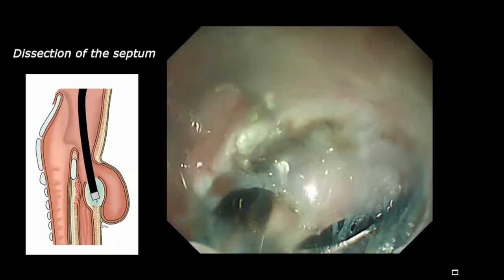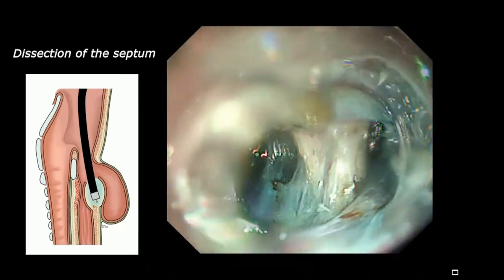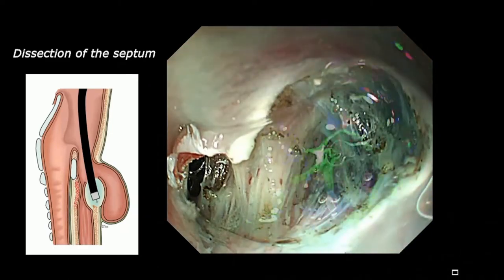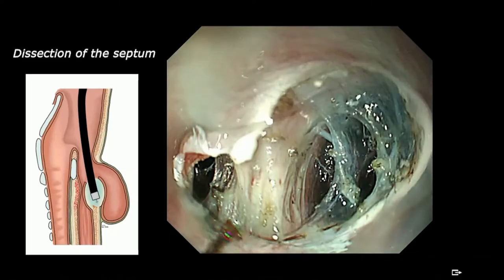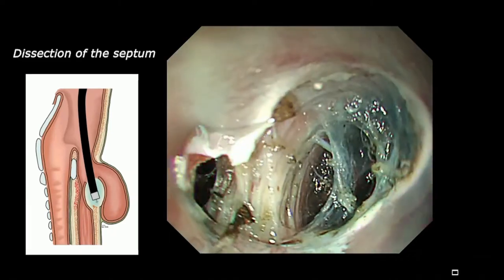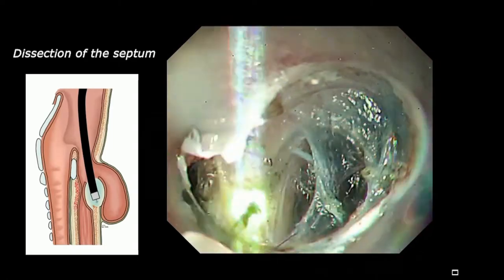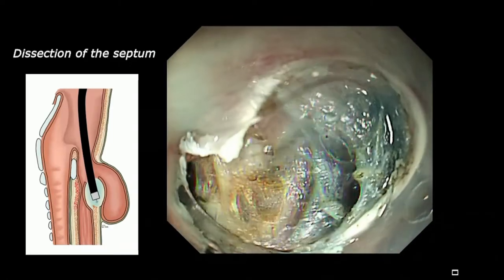At this moment, it used to be that we cut the mucosa as well, but now we dissect only the muscle layer. In this case, we use a very soft distal attachment — we call it a space adjuster — but we can accept any type of distal attachment. Without an attachment, it's impossible.